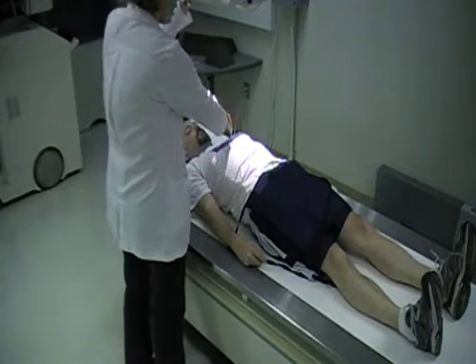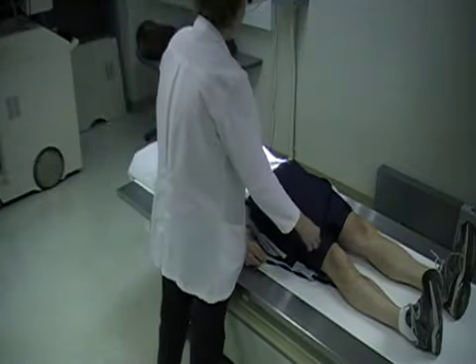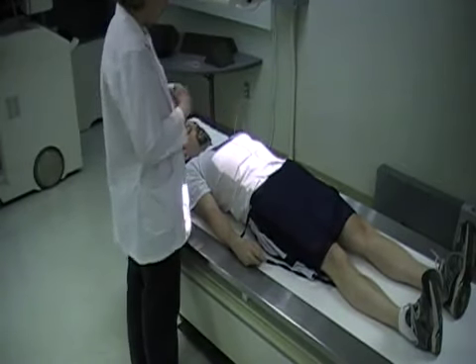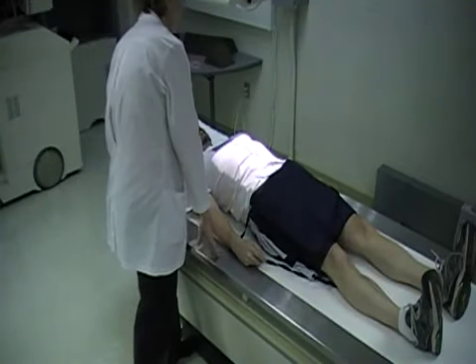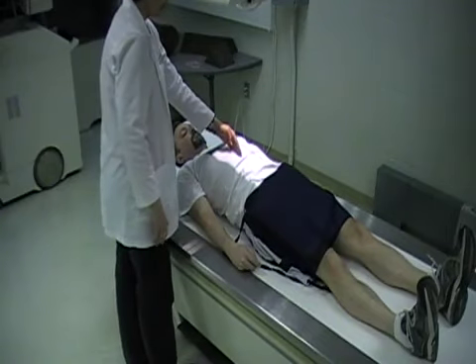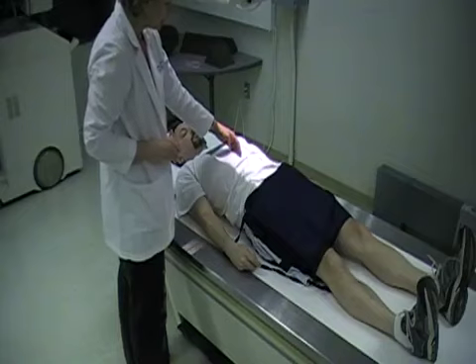Our longitudinal line, if you're using the larger image receptor, you can leave it mid-sagittal. But if you're using a smaller image receptor, you can off-center to the left between the xiphoid and the lateral edge of the body.